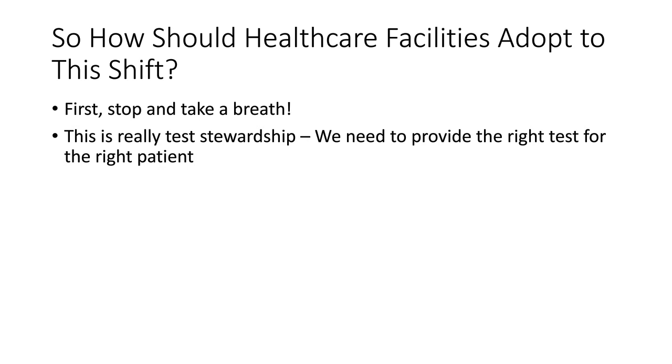The ASCP for several years has suggested that we as laboratories need to provide the right test for the right patient at the right time and at the right cost. And I can tell you that implementing appropriate test stewardship can be incredibly effective in limiting who gets Clostridium difficile testing to the most appropriate patients.